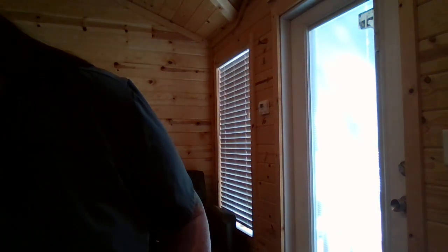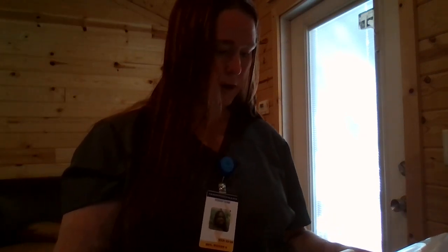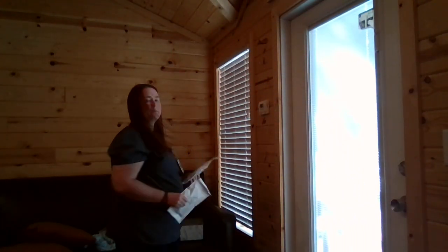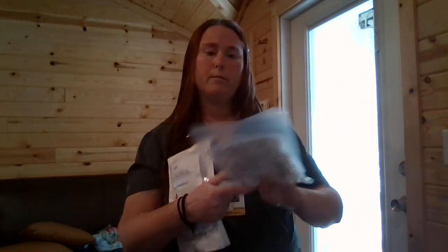So I will need... I grabbed two of them. I don't need two of them. So I have an IV gravity set with needle, and I am supposed to have a secondary set. I grabbed, aha, a secondary set. This is going to be for my piggyback, which will be my medication.